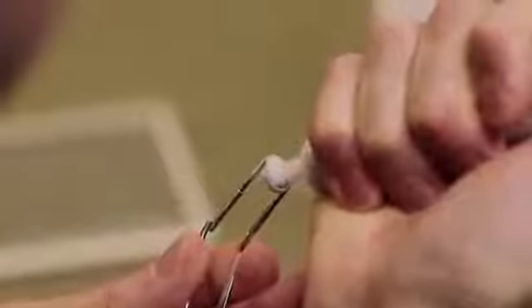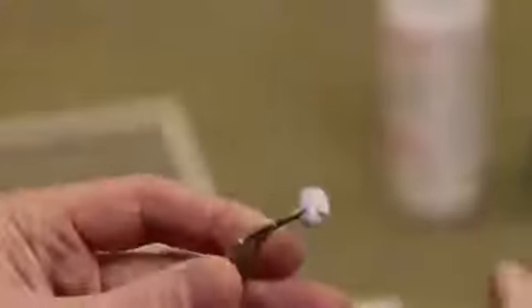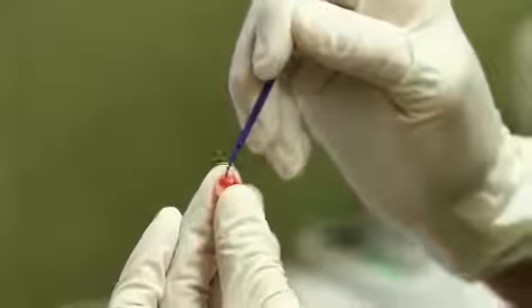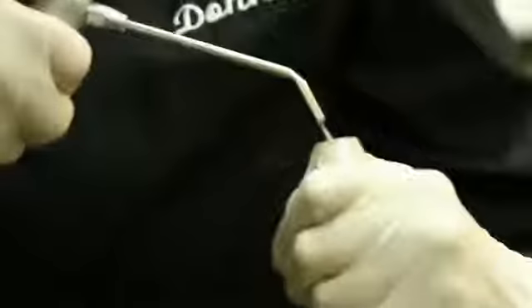When we put this in the oven, it goes from lithium metasilicate to lithium disilicate, and we have to have our margins supported or the crown may not fit as well. We have acid etched the intaglio of the crown with hydrofluoric acid for 20 seconds. This is part 2.